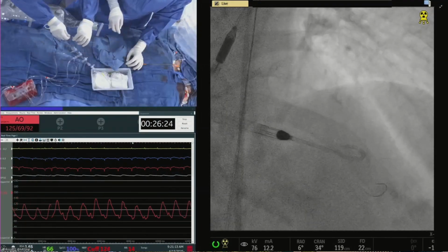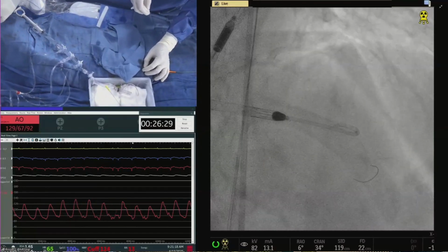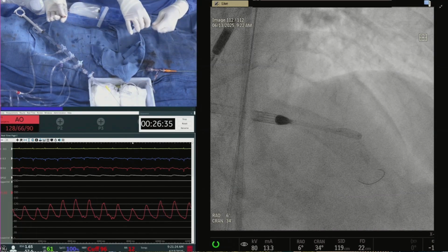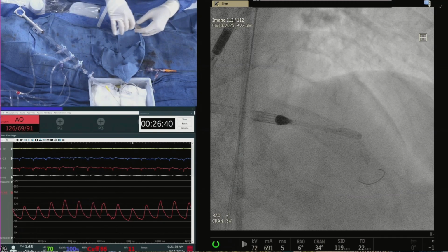No changes yet. To begin with, this patient may be well compensated, though we did not see any collaterals, but chronically occluded vessels. You see the tram-track calcium, so we will do the rotational atherectomy.